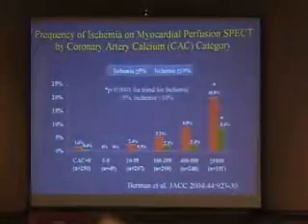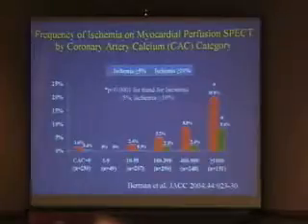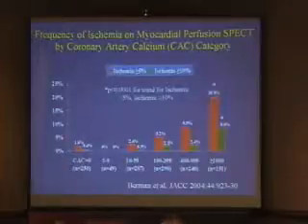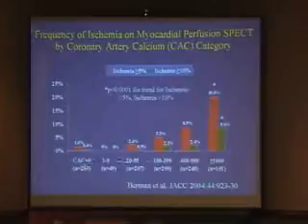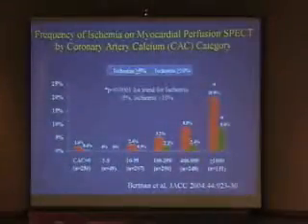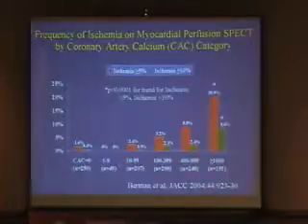The article earlier referred to tonight in JACC just earlier this year, we evaluated approximately 1,200 patients who had SPECT scanning and EBCT or coronary calcium scanning. And this slide horizontally illustrates the standard calcium score categories, and vertically we're showing the percent of the patients who had ischemia by nuclear testing.